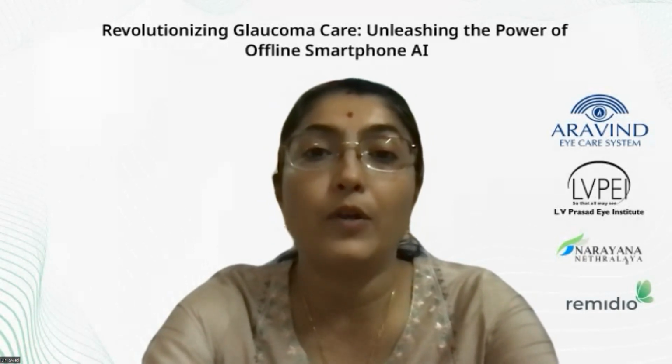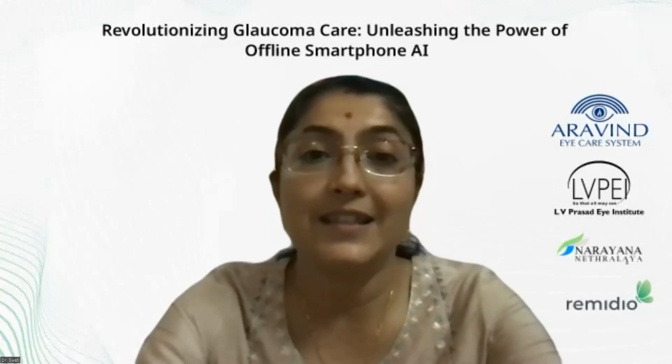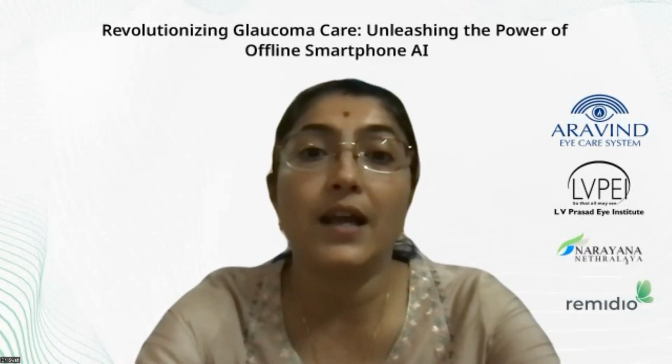And also in our vision centers, we don't always have glaucoma fellows posted. So we have residents also posted over there, and residents also got exposed to these images. What they used to ignore, they started looking into when the AI used to give them, okay, this is 0.6 cupping. Then they used to revisit and re-see that image, and then they also started learning. They were excited that, madam, we saw a notch today. So even before coming to the glaucoma clinic, when they were posted in vision centers, they started learning from there itself. So the AI has helped the sisters, the doctors, and the fellows, all of them.